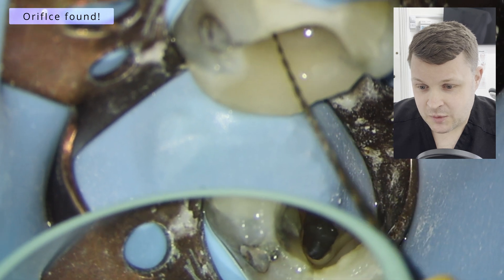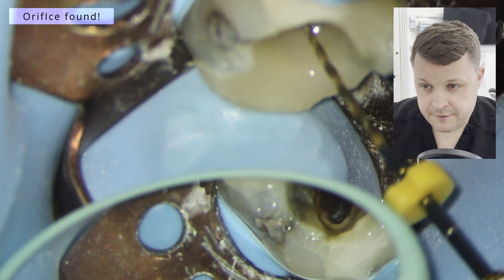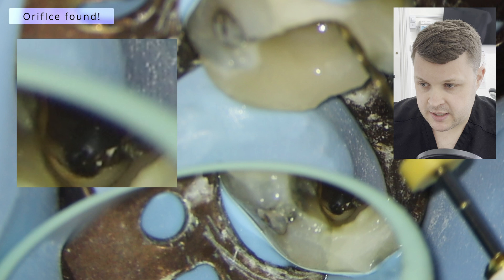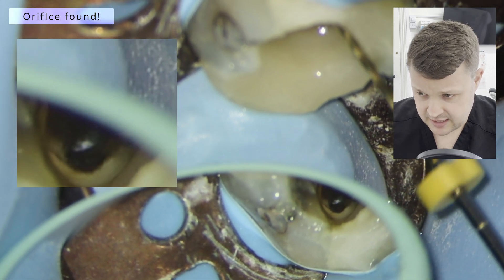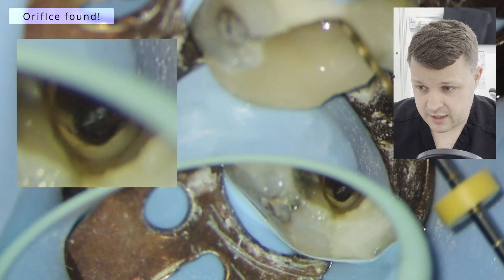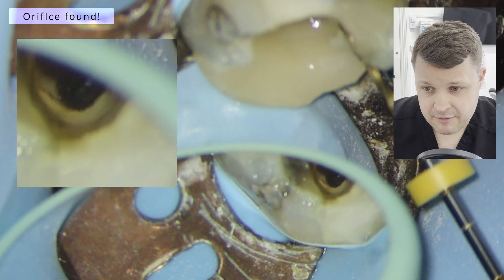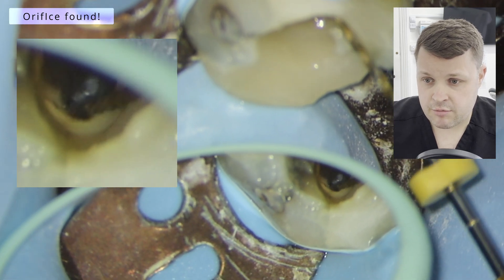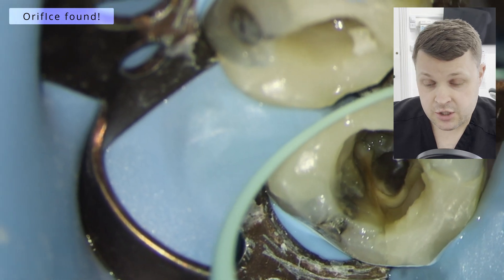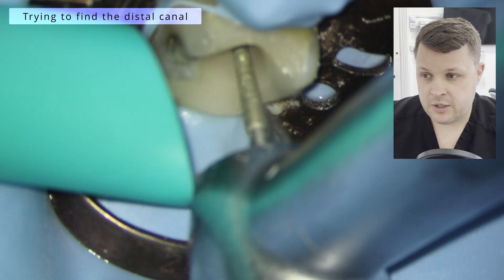And eventually we find the orifice, which is the best feeling in the world. We're going to use this HyFlex 1503 or 4 just to open up this canal space. It's really, really tough to see this because this is a really deep portion of the tooth. The great thing I like about these HyFlex glide path files is they just want to drag you down into the canal — you don't have to push them. And if you feel like you're not progressing like you should be, you just pull it out and recapitulate.